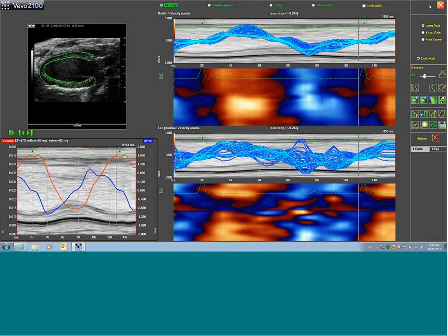If I could comment on that, vessel strain is something Stephanie mentioned in her presentation. It's not a full-fledged product at this point, but it's on our development roadmap at VisualSonics, to try to implement some of the work shown by an early study by one of our friends and collaborators. If you have any more questions about that, you can certainly contact us, and I can get you more information about the timing and release of that software.